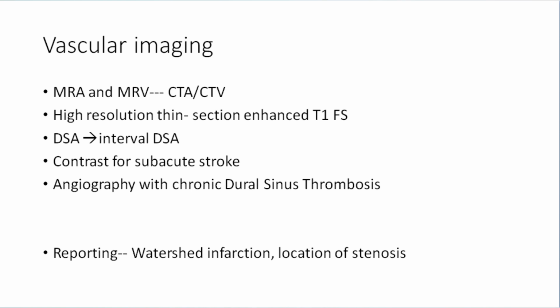And that is where the technicians come in, because if they do a great job, it saves the time of the clinician. But sometimes you still need to look at the raw imaging. If it's a case of RCVS, reversible cerebral vasoconstriction syndrome, you need to do interval DSA. So after medication, do those vessels open up or not? What's the age of the patient? So what I will recommend from today's presentation is that if you want to learn, please get back to your clinician. And if the clinician wants to learn, they should get back to you. So you need to do digital subtraction imaging in that case to see the change.